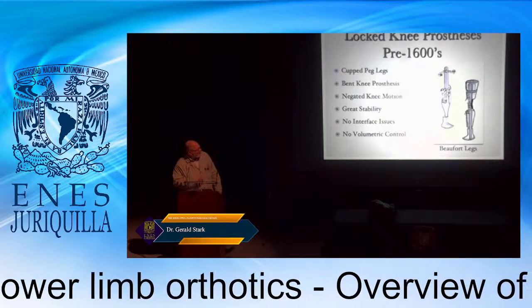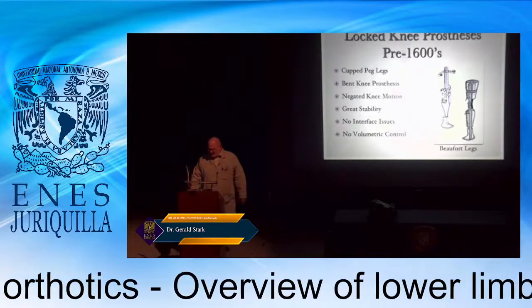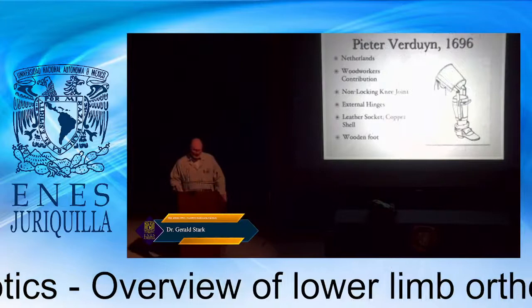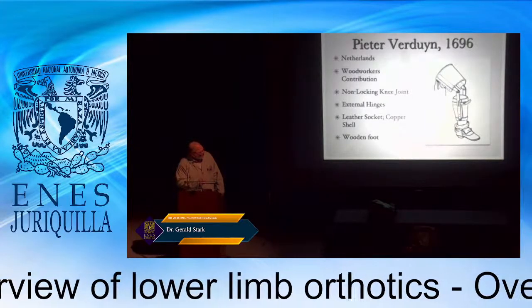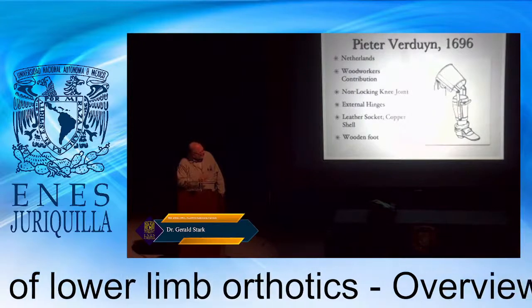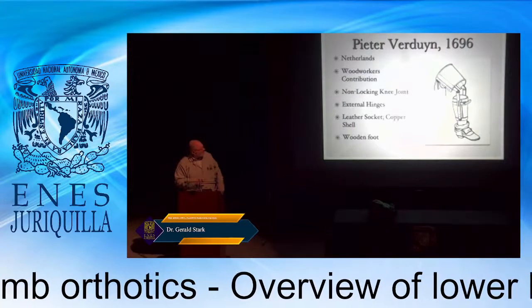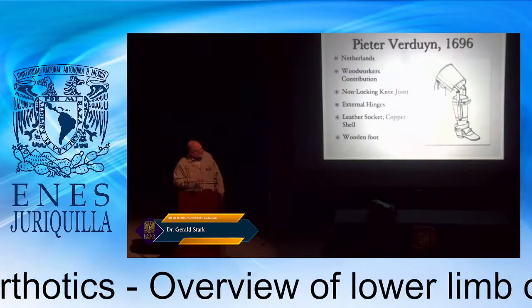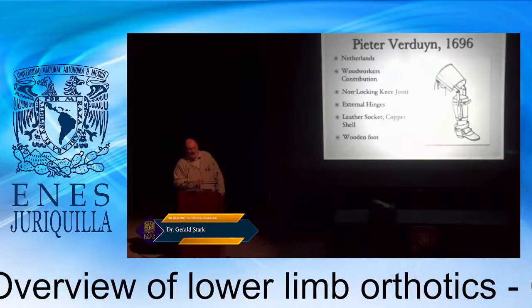But this gave you great stability, barely covered the leg, so you didn't need to worry about any sort of impingement. This leg's from 1696. You can see you have an adjustable distal end. You have a corset. So a very lightweight system, very adjustable. And then you have this very fetching high-heeled shoe for a man right here.